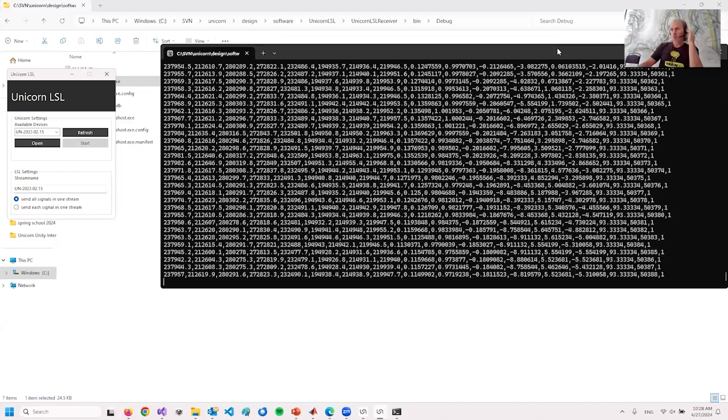How can we achieve 2 simultaneous Unicorn connections at the same time on one computer? Bluetooth is a bit limited, so I wouldn't recommend doing it on one PC, but 2 devices mostly work well. From 3 devices on, Bluetooth is very likely to crash. The best solution would be to have 2 PCs, and for instance take Lab Streaming Layer on both PCs and then stream to another application that is receiving from both, because then you can get a stable data connection on both PCs. Each one connects to one Unicorn, and you can merge the data streams in another application.